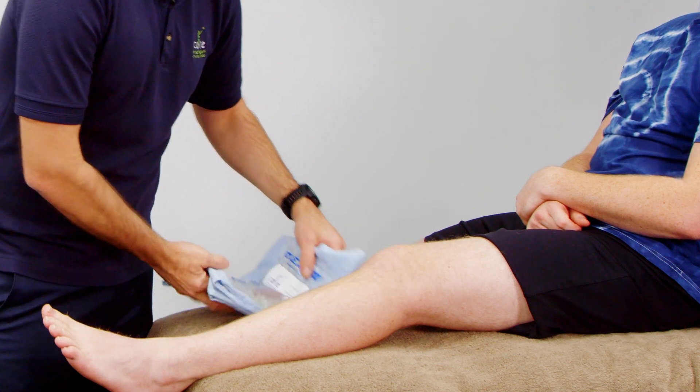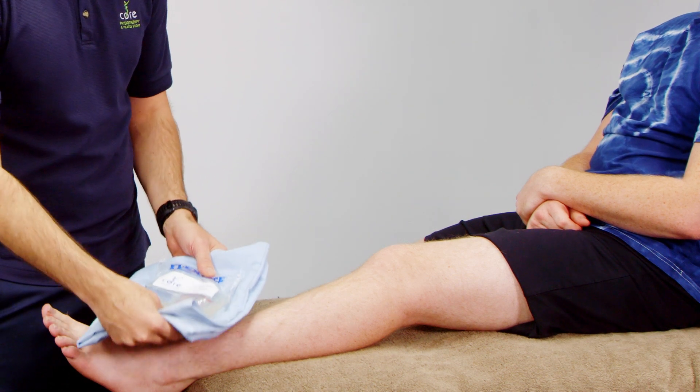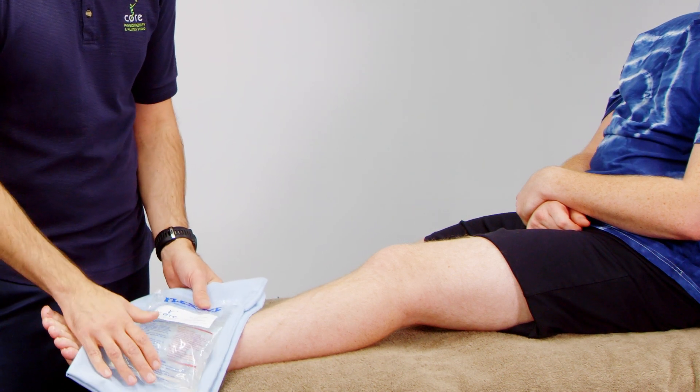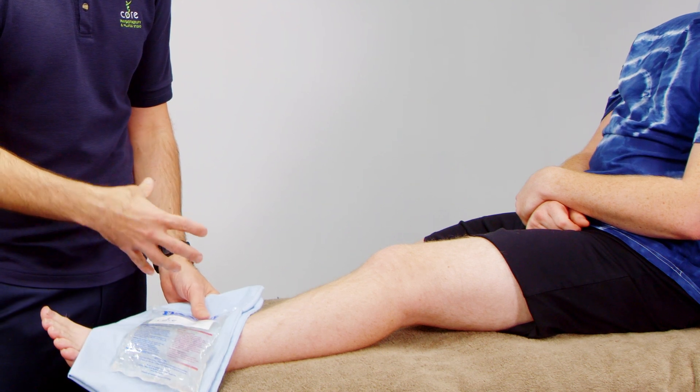We do recommend putting something like a tea towel or a pillowcase underneath it. As you can see, we've got it over the joint, and that gives a nice even pressure and cooling over the joint.